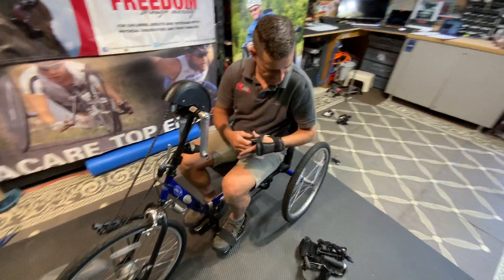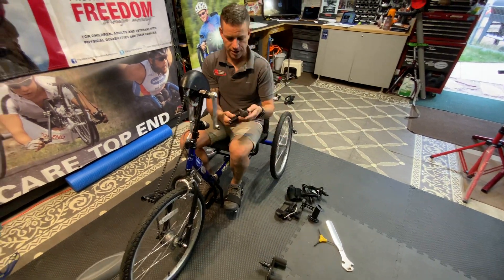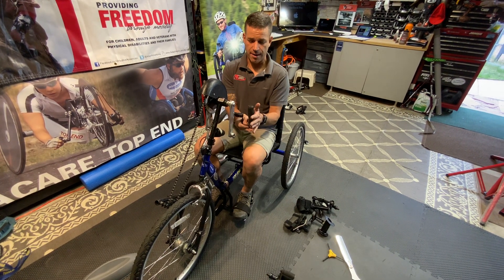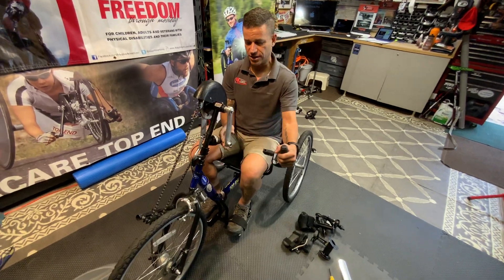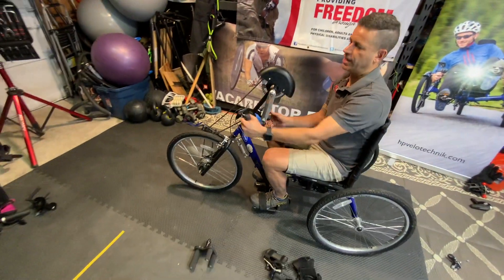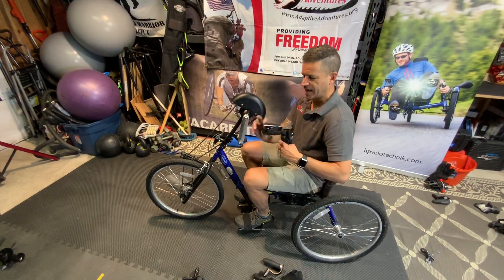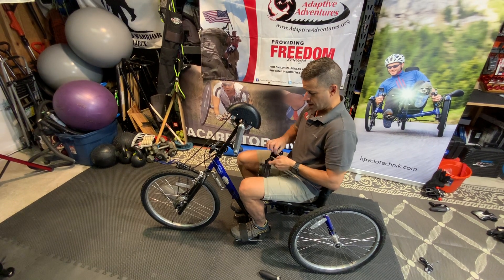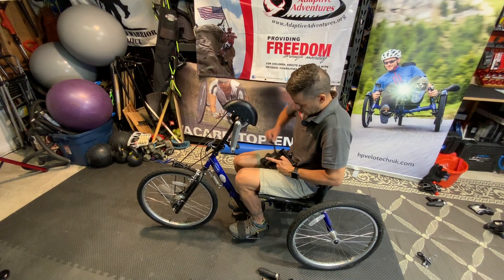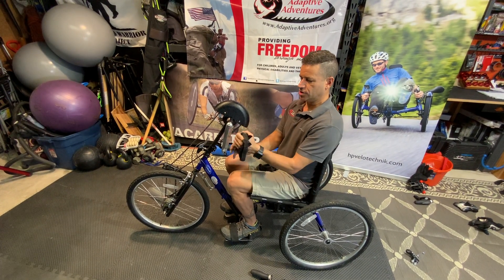There are other devices for somebody that has incomplete grip. Through bikeon.com, we got all of this equipment. It's an ergonomic-based hand pedal that allows it to clip in and then go through the full range of motion for the hand cycle. There are also other modifications with straps to keep your hand on the pedal for the hand cycle without the need to change the grip.